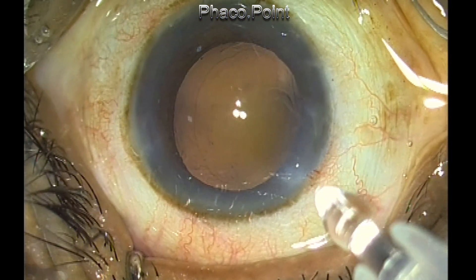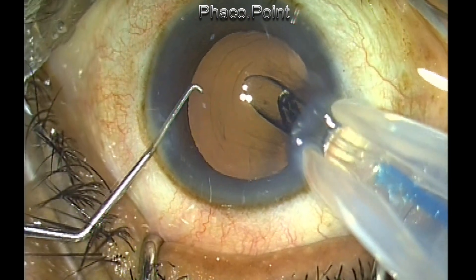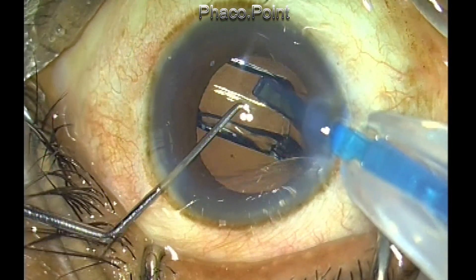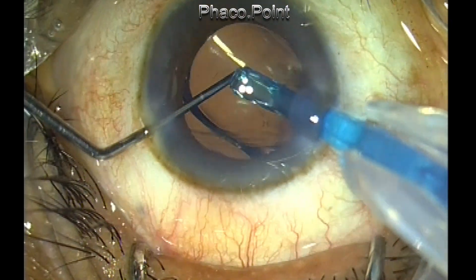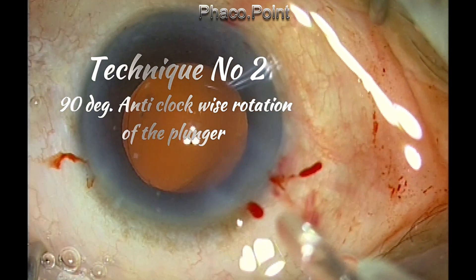I have retracted the nozzle so I can have an in-the-bag injection. The leading haptic comes out fine; the trailing haptic is curled up near the pusher. So you just pull it back, and as you pull it back, you then press the lens posteriorly to inject it into the capsular bag.